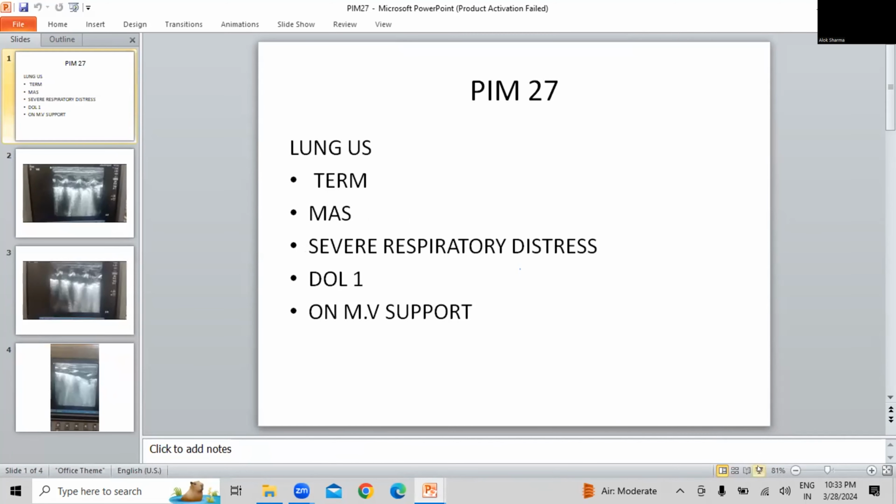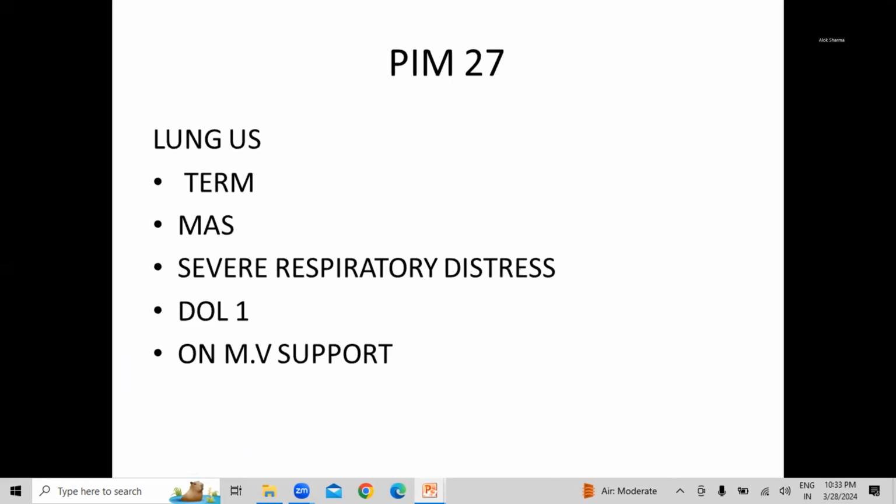I would say that if you see anything that doesn't look like tissue, that makes you feel odd in its appearance, that Nadia said looks a little bit cystic, please always do comprehensive scans in that situation. And again, on Sunday, I will talk to you about what a sweep is, which we haven't covered. A sweep is a very easy way of moving down the chest, going through each intercostal space to visualize everything. And in certain machines, you have what are called extended convex views, which means you can get the whole image, anterior, lateral, and posterior, in just one view. But I'll show you how to do that.